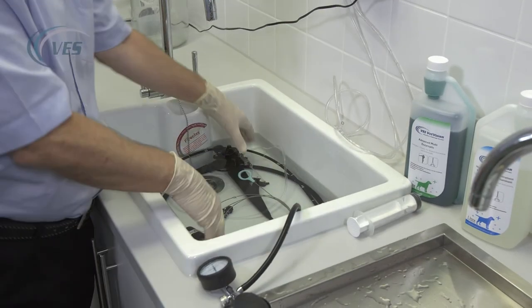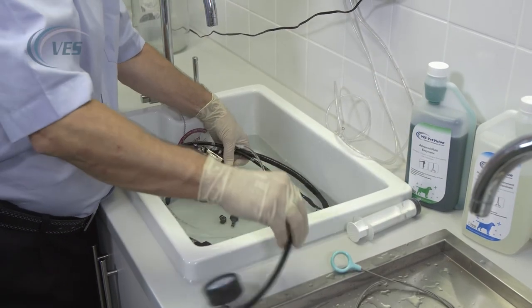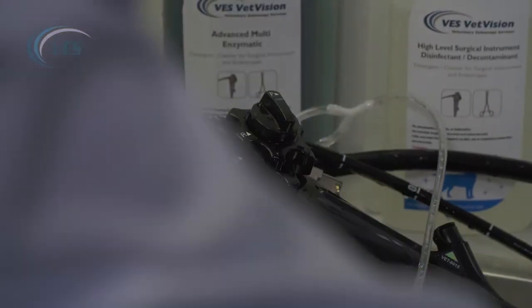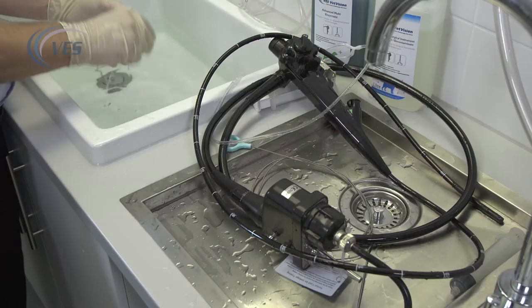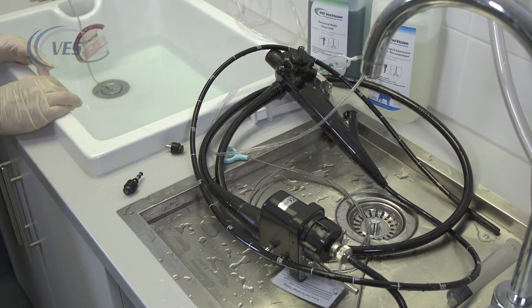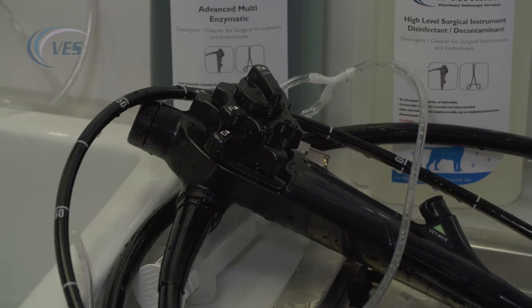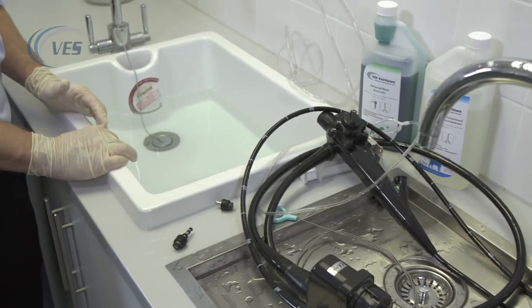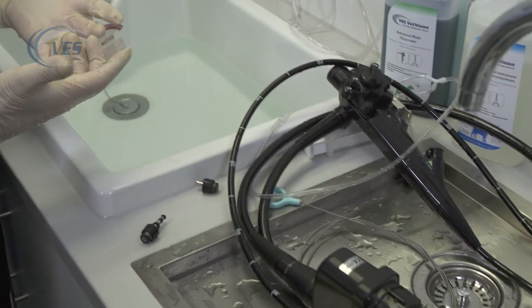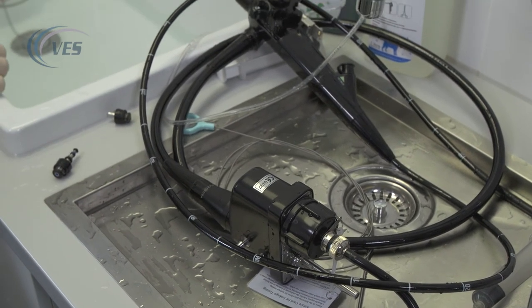Once we've finished with the disinfectant we'll remove the scope. Don't forget your buttons for your biopsy channel. What we do then is get a sink of cold water — it doesn't have to be deionized or distilled water. Preferably add something like Milton baby fluid in there just to fully disinfect the scope, which makes everything a lot nicer. Same as before, just flush through three or four times. Once we've done that, we're ready to go through the drying procedure.